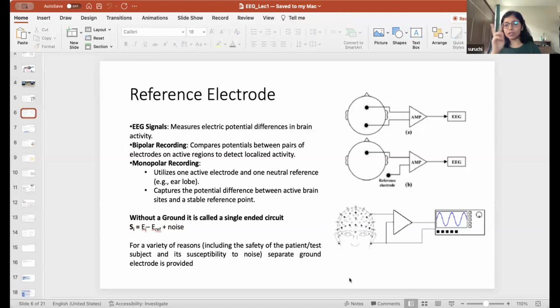Whenever we talk about voltage, we talk about a difference. We don't talk about a single pole. We talk about the difference between two things. When we talk about a battery, we talk about the voltage difference between the top and the bottom, right? Something like that. And there is a fixed position where we put this reference electrode. Ideally, yes. In some cases there could be differences, but for our cases, our reference would be one single place, and every electrode is taking reference from that same particular electrode.